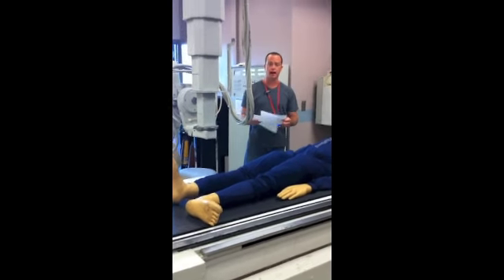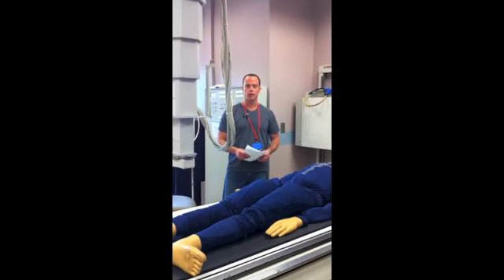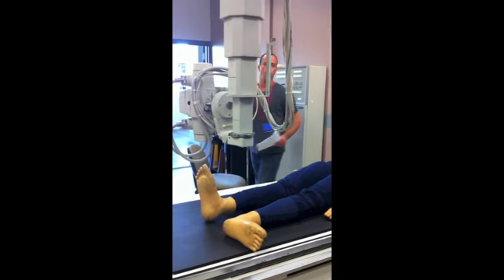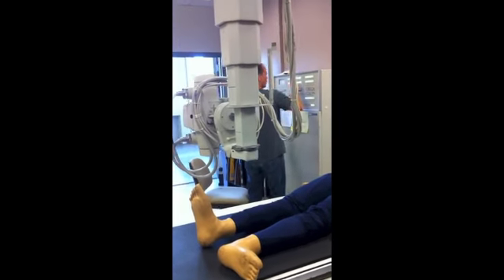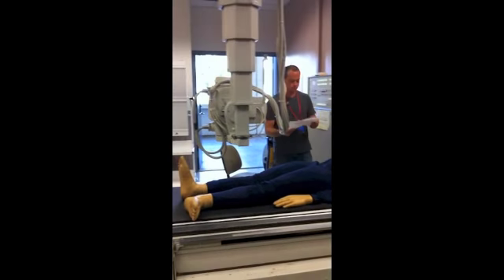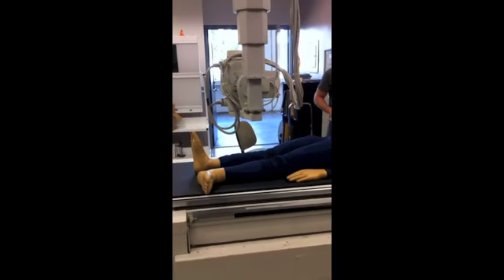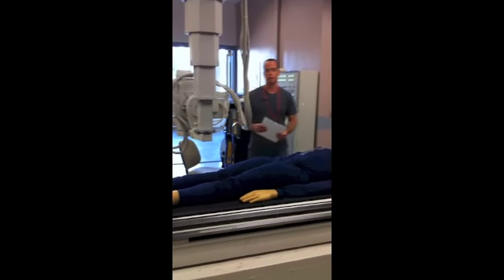Okay, now time to set my technique. A good technique I like to use for an average size male adult is roughly 110 at 8. 110 kVp at 8 max. Set the technique. So now the tube is properly detented, the IR is in the bucky, and my console is set up. Time to bring the patient in the room.